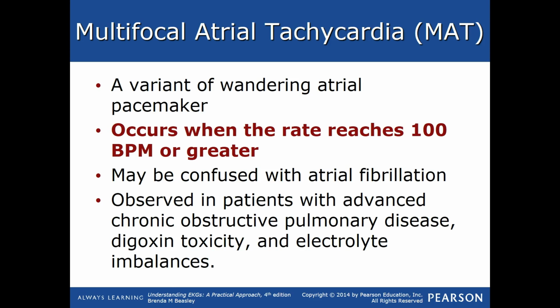We move on to our multifocal atrial tachycardia. Multifocal, remember, your foci is the spot where the heart is being paced from, and this is saying it's multifocal, so it's got different spots that it's being paced from. So it's a variant of wandering atrial pacemaker. Remember, in wandering atrial pacemaker its pacemaker site was moving around, and that's why you would get the changes within the P wave.